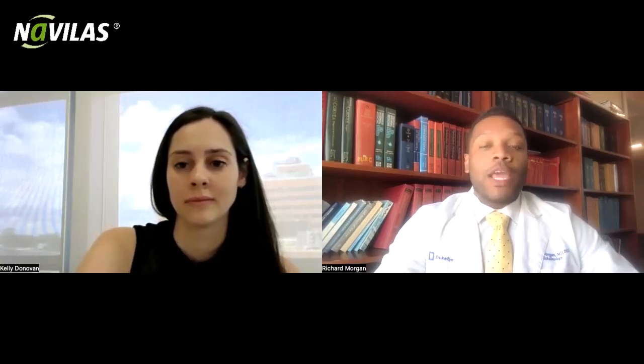Yeah, that's a great question. I think it's important to be clear and reassuring. We really educate patients on what to expect before, during, and after the procedure. It's important to set expectations and address any concerns they may have about the entire process. So I typically tell patients that the laser shots may feel uncomfortable, kind of reminiscent of a rubber band snapping on skin.